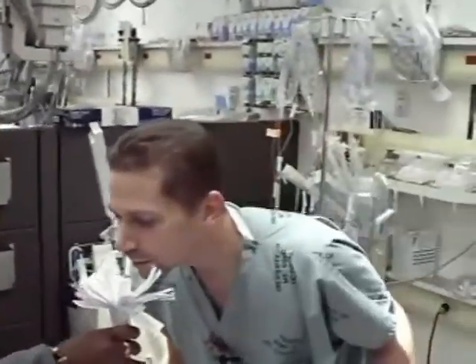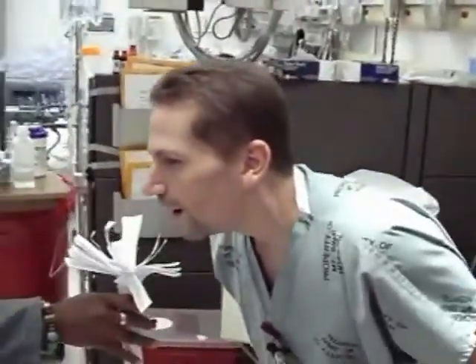That will be a sniffing position that will not allow you to intubate the patient. Now we'll demonstrate good sniffing position. Here is an example of good sniffing position — I'm still sniffing, but now you can see my head is back and my neck is flexed forward. And that's good sniffing position.